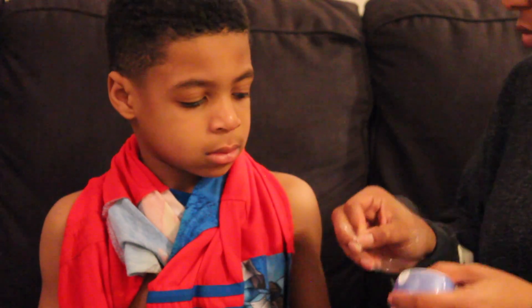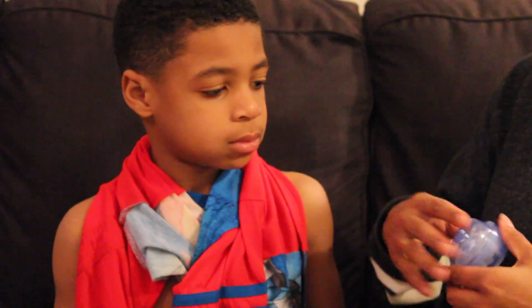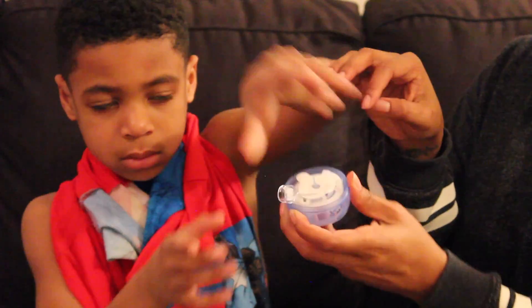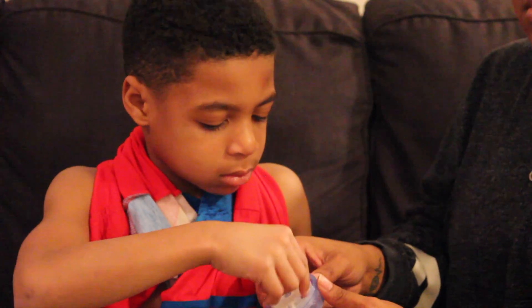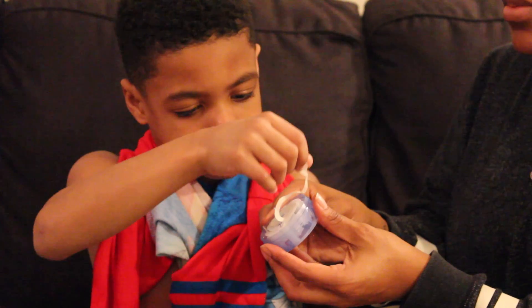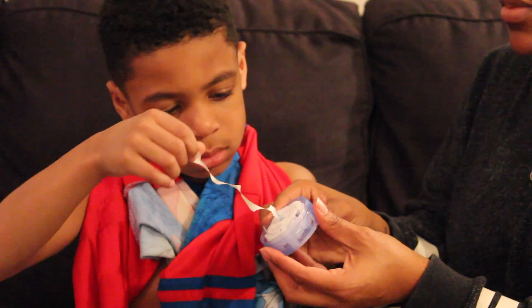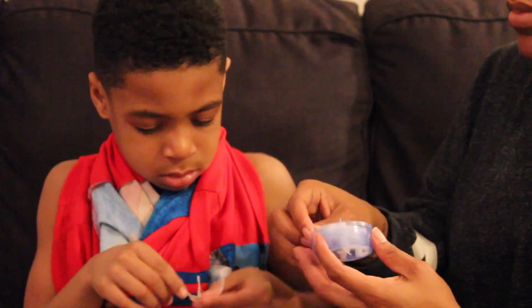I'm removing the red tab and the clear packaging from the infusion set. Now Landon is going to gently pull back the tape and expose the adhesive — this is the tacky part that's going to actually stick to his skin.